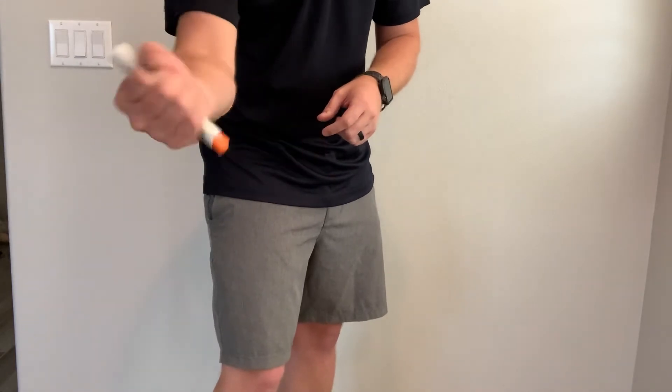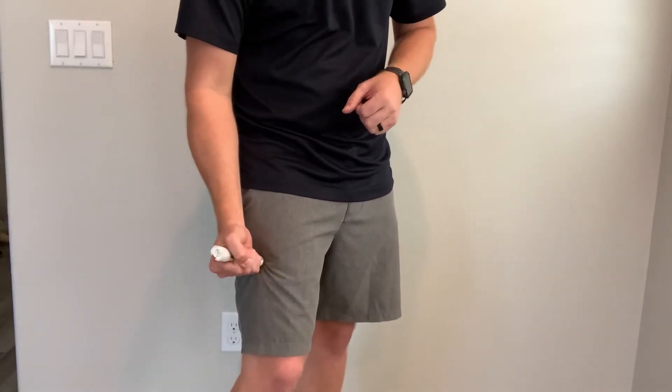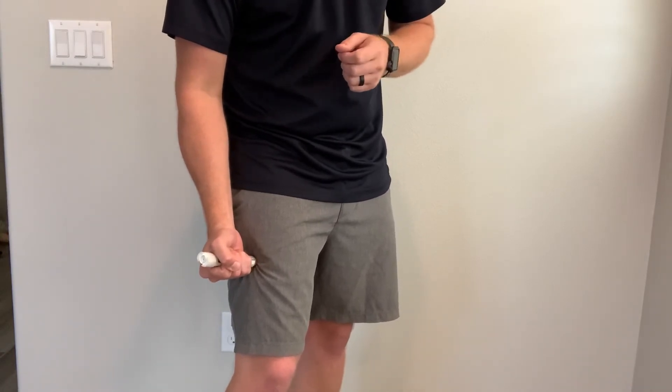Grip that EpiPen really tight — the orange side is going to go into their thigh and you're going to hear a click. After that click, you want to hold it in their leg for 10 seconds so that all the medication goes through.